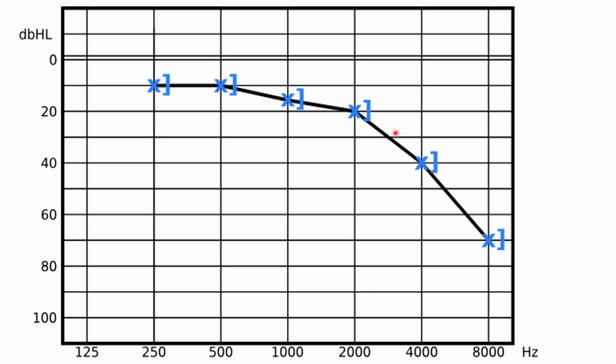So there is high frequency sensorineural hearing loss, but this patient's hearing level will be normal, because as I already mentioned, in speech frequencies there is no hearing loss. So the patient will present to you with the complaint that if somebody is speaking from far, I am not able to hear that, but in my normal conversation there is no problem.